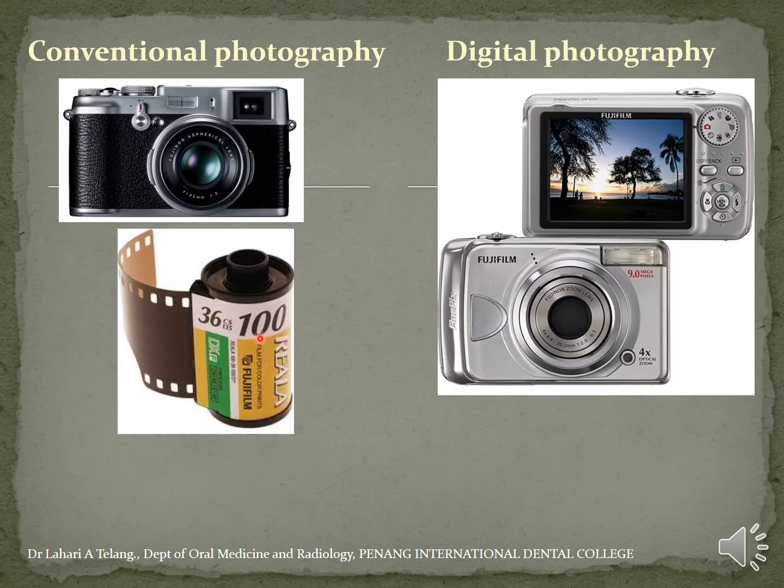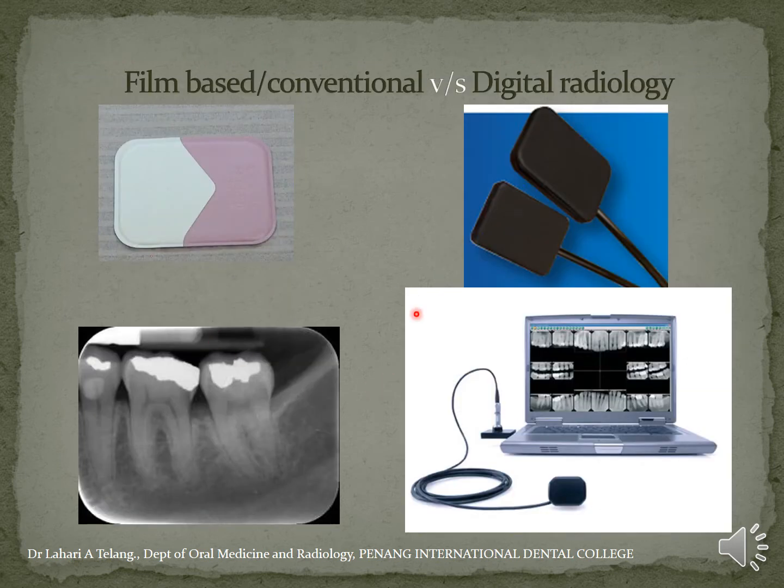Here, in photography, you still need visible light as your form of energy to take an image. In X-rays, in a radiograph, you use X-rays as a mode of energy to capture this image. I hope you understand what I'm trying to make you understand. I'm trying to give you an idea that both visible light and X-rays are a form of electromagnetic radiation, or they are both in the electromagnetic spectrum. Just that light is used for taking photographs and X-rays are used for imaging the human body to see radiographs.